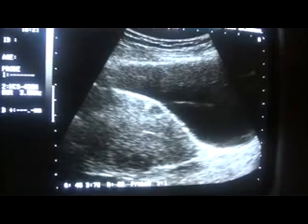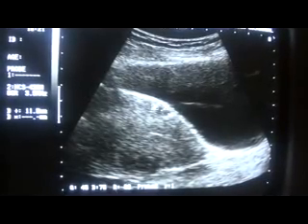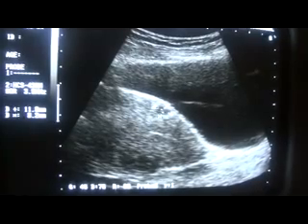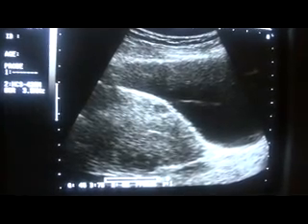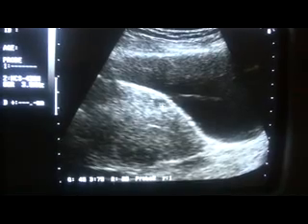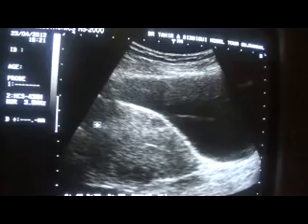Endometrial canal is this. This is the endometrial canal. So this is a case of multiple solid focal lesions in the large and bulky uterus, and interestingly, none of them is seen encroaching upon the central clear endometrial canal except one, this one.